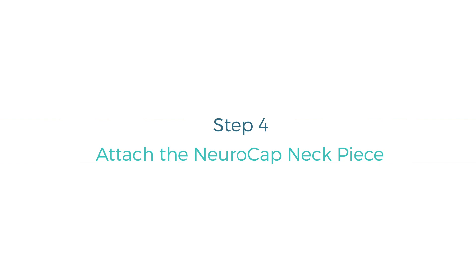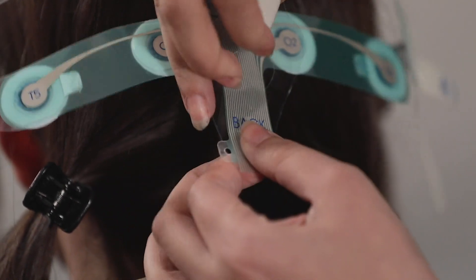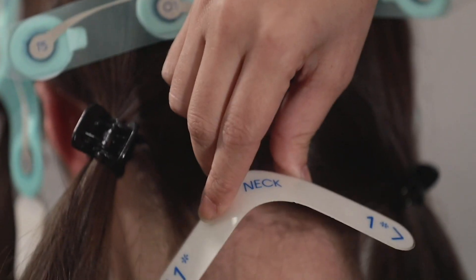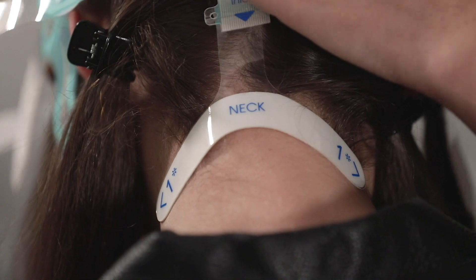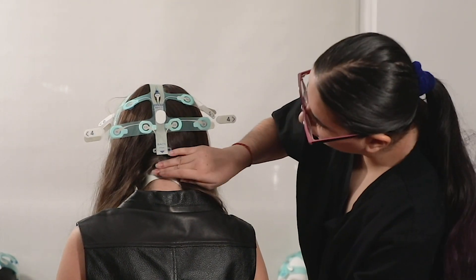Attach the NeuroCap neck piece: pull the strip of NeuroCap through the hole of the neck piece and attach the neck piece to the back of NeuroCap. Peel off the adhesive cover and place the neck piece on or slightly below the circle marked with sizing dimensions across the neck. Center the NeuroCap evenly along the sagittal plane.